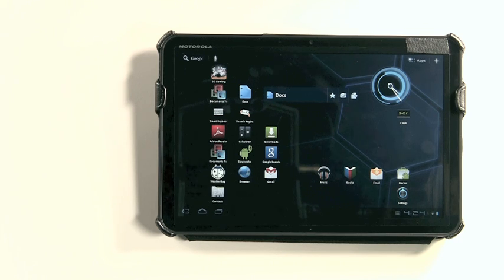Invacare's Mark 6 electronic platform offers the user many advantages and options for power wheelchair control. In today's world, the driver control needs to do much more than drive the chair or operate powered seating. This short video will explain how to gain independent access wirelessly to a PC tablet, the Motorola Xoom, through the driver control.